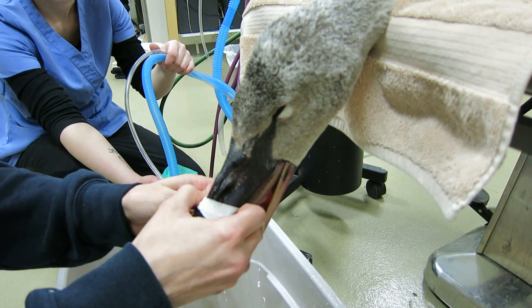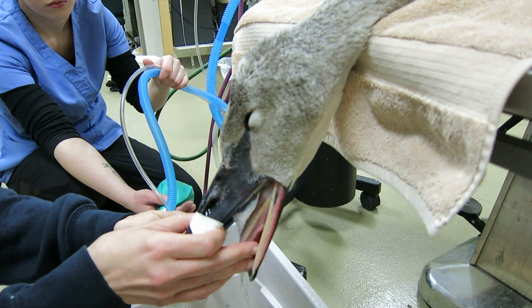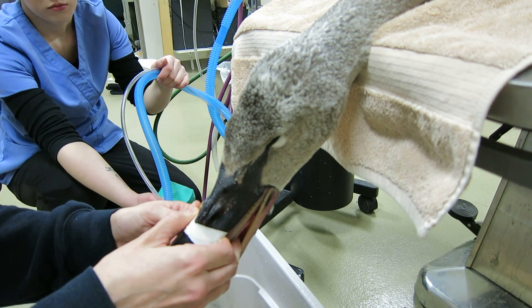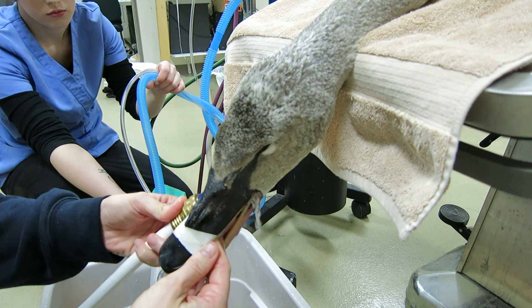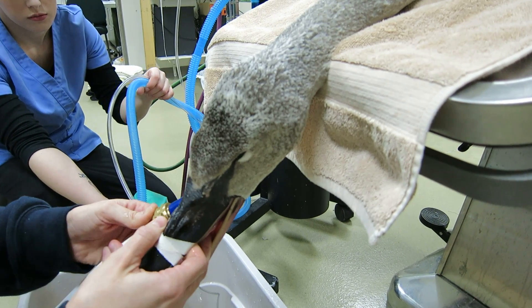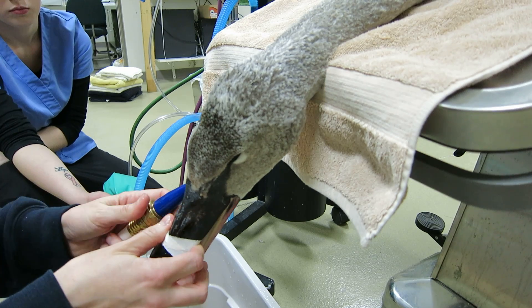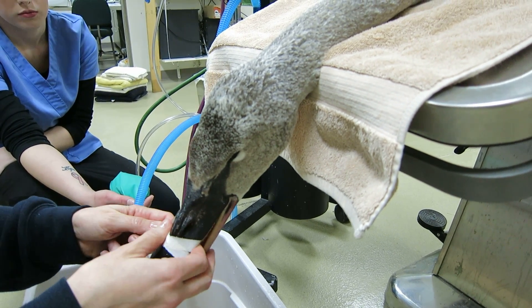How are we doing, Claire? Good. This is a very safe procedure for the bird — it's not hurting the bird at all. The main risks of this procedure are actually related to the anesthesia itself. The water isn't going to hurt the bird or cause any long-term damage, and the tube is very smooth — it's not going to damage the esophagus. So depression of the respiratory system and heart rate, as well as any aspiration risk, are the main risks.